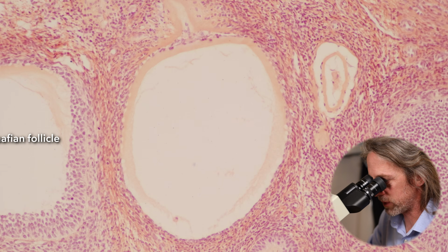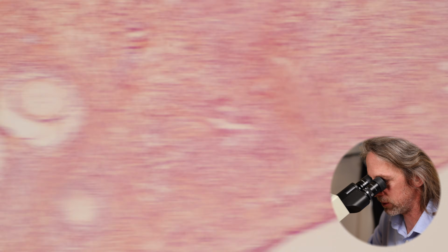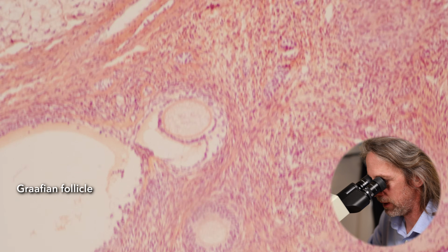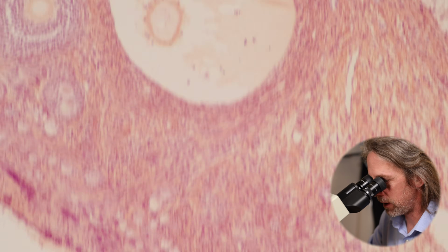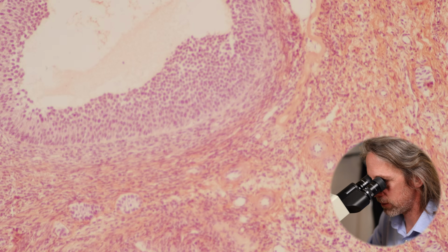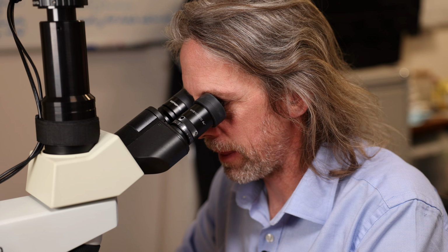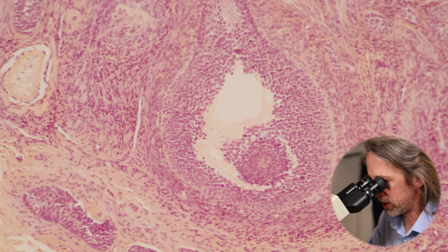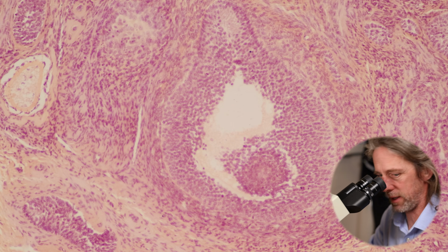These circles, which haven't got an oocyte in them, are just missing the oocyte from the plane of section, because of course this is a big sphere, right? I'll bet I won't find one, because everything else has been going really well, isn't it? No. You might have to use your imagination. Maybe that's as close as we're going to get.